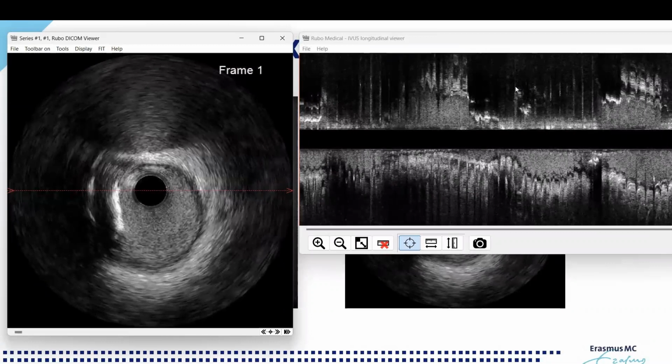And look at that, you see the distance from the middle part of the IVUS catheter to the first leading edge of the calcium, and exactly the double the distance. You can see the same shape, however, it's a bit weakened in there, and this is what we say is reverberation. That means that this particular calcified plaque we can consider to be less than 0.5 millimeter thickness, approximately.